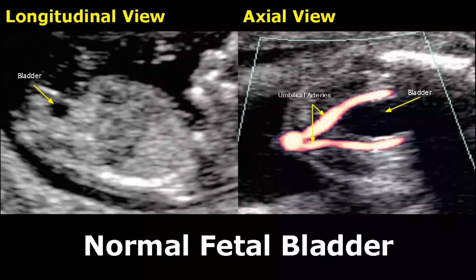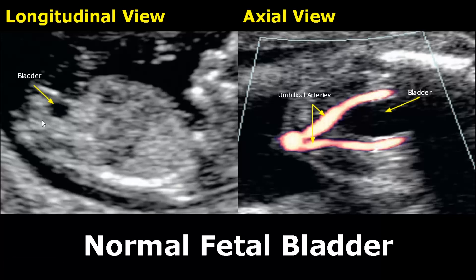Hello everyone, this is Dr. Sam, and today we will study fetal bladder ultrasound. Here we have the longitudinal and axial views of the fetal bladder — it is a fluid-filled, anechoic structure in the pelvis. This image is with Doppler; we can see the umbilical arteries surrounding the bladder, which can be useful in locating it.